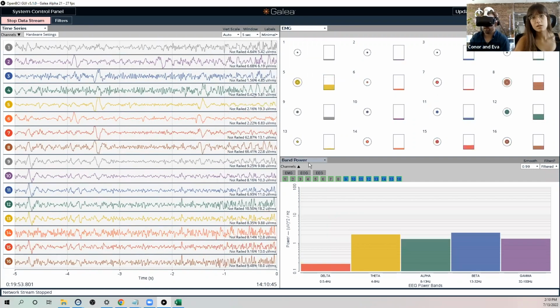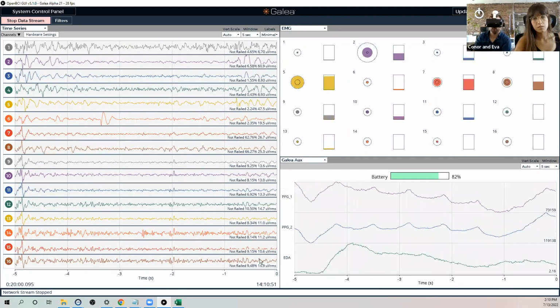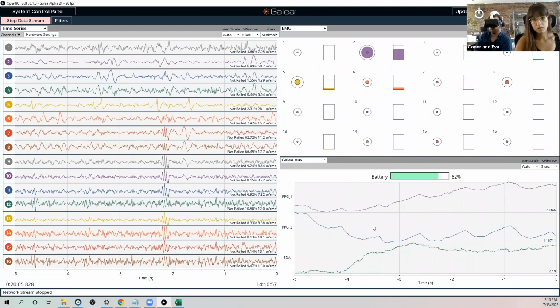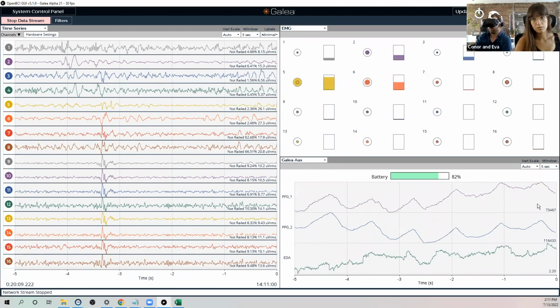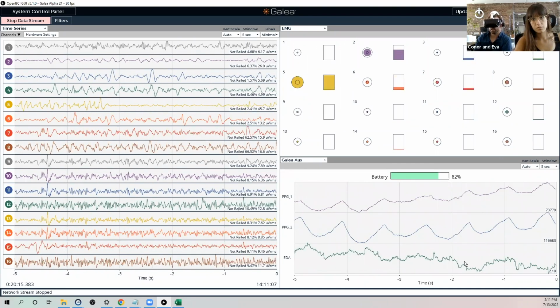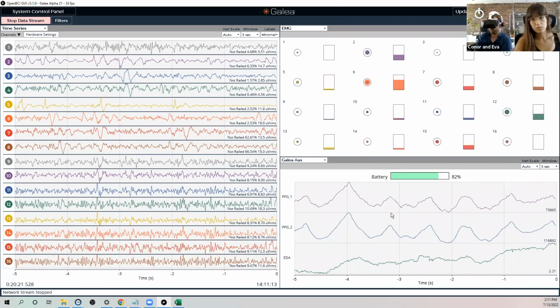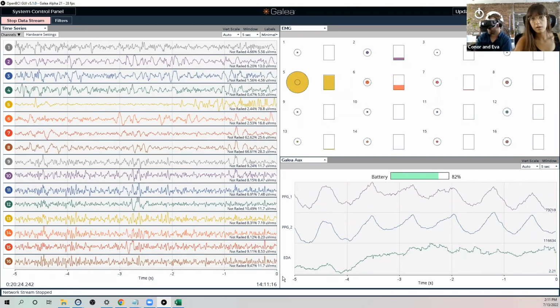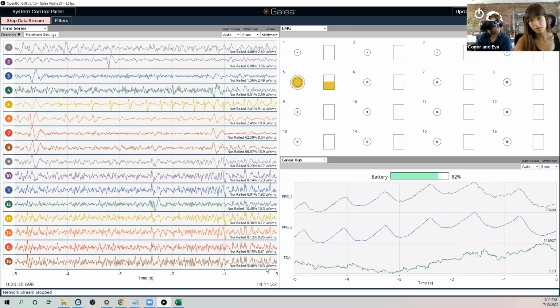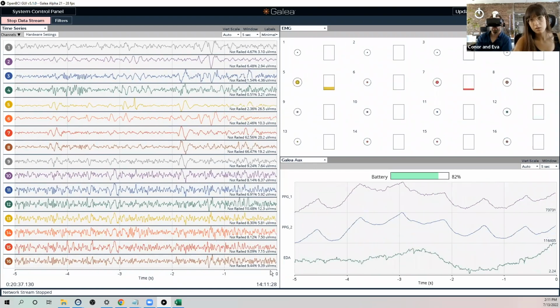I guess to add to that, that's for all the EXG channels. The Galea aux data has a different sampling rate, and we're actually doing a breaking change to BrainFlow and the stack to subdivide our packets into basically per data type files. So you'll have a PPG data file, which will have its own sample rate, an EDA data file with its own sample rate, and then an EXG file that has higher sampling rates than what's necessary for PPG and EDA. In the current file that I showed you, they're synchronized. So we synchronize them even though the PPG and EDA have lower sampling rates. But like Conor said, in the next version, we're going to have individual output files so that it's more flexible.